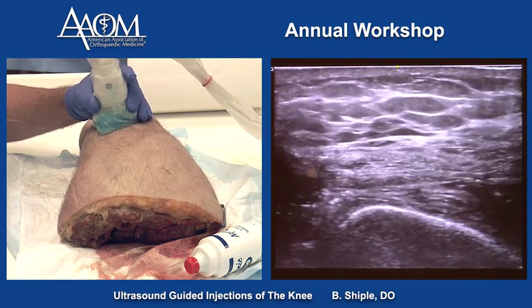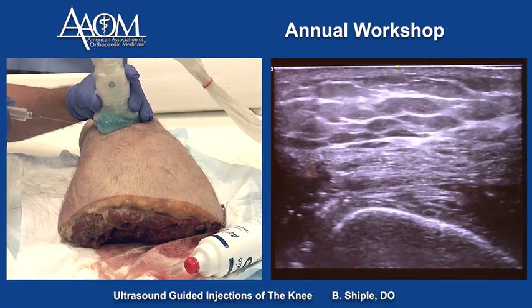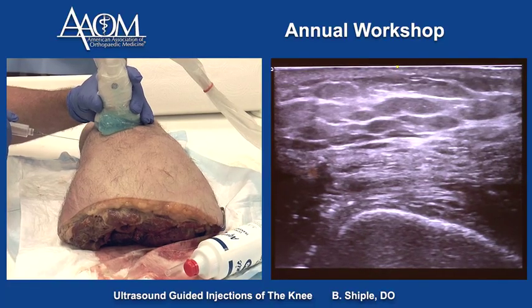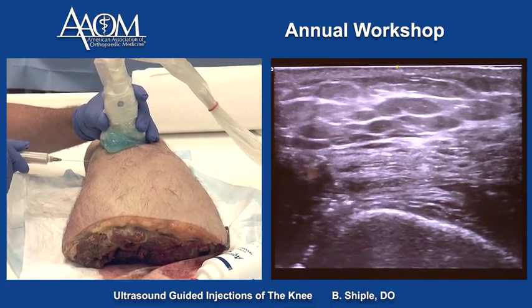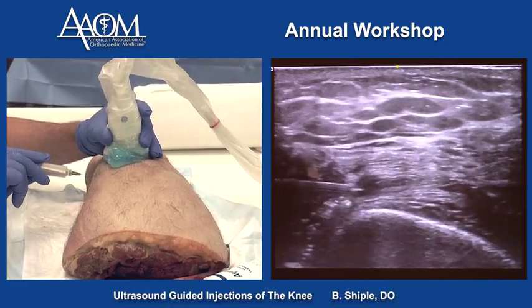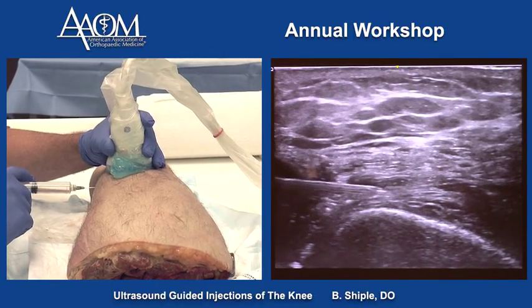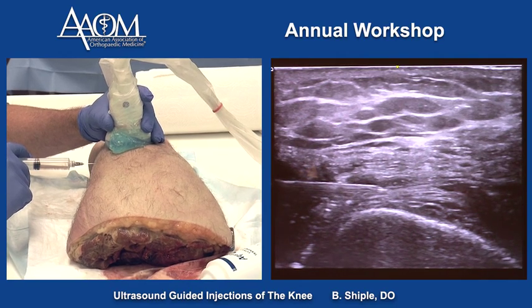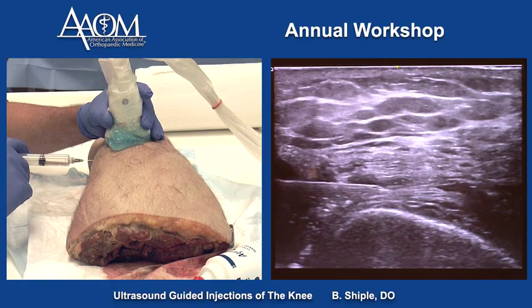To get the needle at the right level underneath the quadriceps tendon, I need to slide down the side of the knee about two centimeters for needle entry. We advance the needle and it looks like it's in the joint space right there.